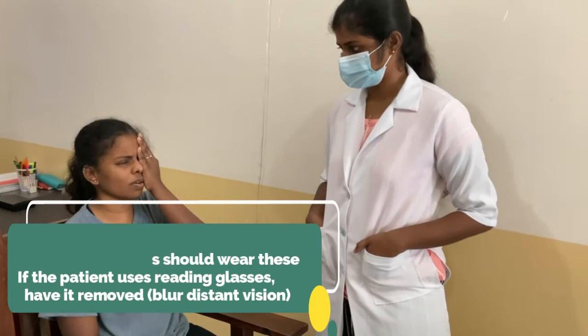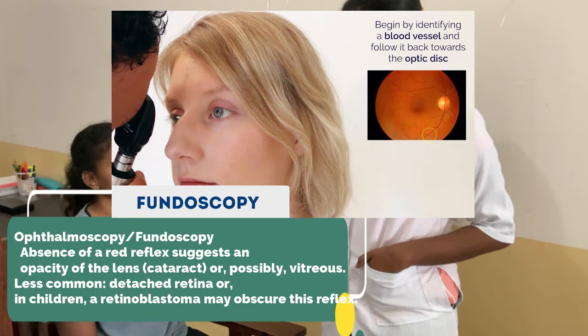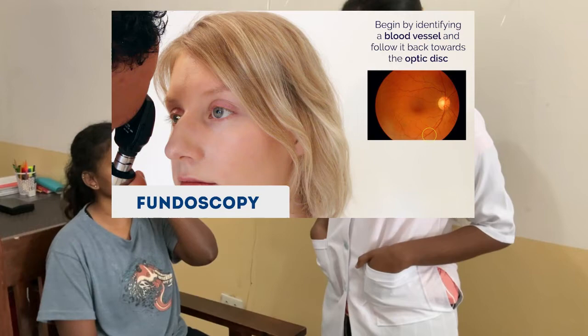Finally, during the fundus exam, using an ophthalmoscope, one can look at the structures in the back of the eye. Realistically, this is very difficult to do properly, especially without dilating the patient, and other instruments are better suited for this procedure. An ophthalmology consult should be called in many situations for further investigation of the fundus.